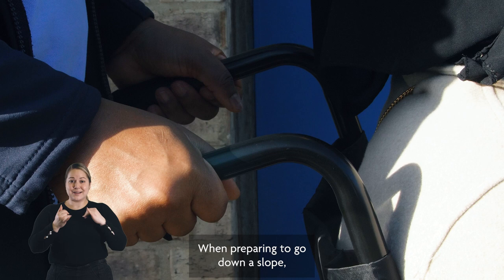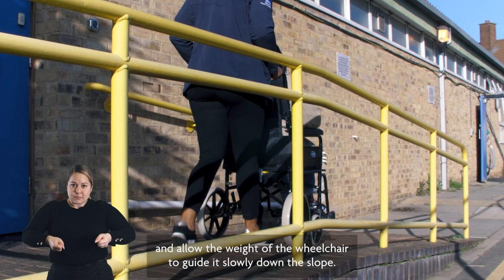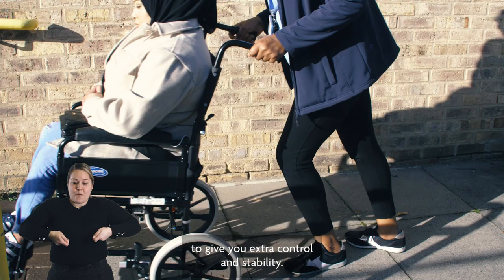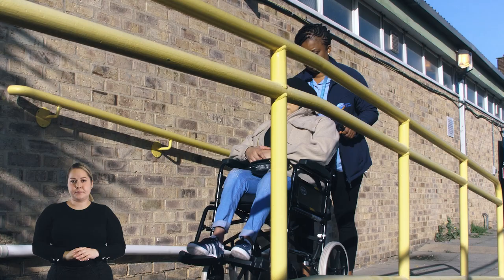When preparing to go down a slope, first make sure you've got a firm grip on both handles and allow the weight of the wheelchair to guide it slowly down the slope. When preparing to push the wheelchair up a slope, be sure to bend your knees and lean forward into the wheelchair to give you extra control and stability.